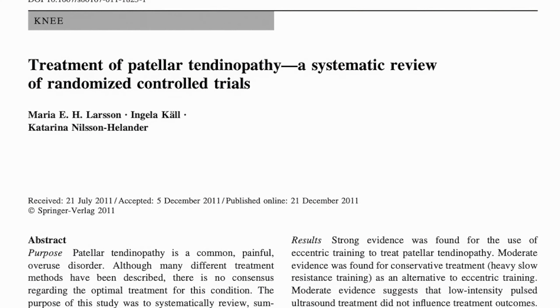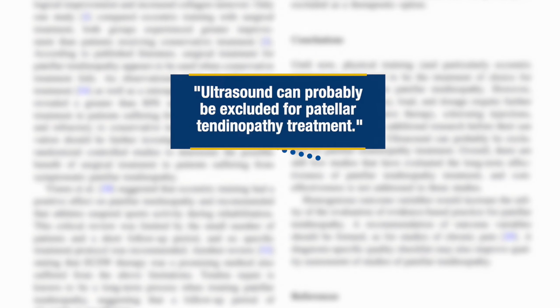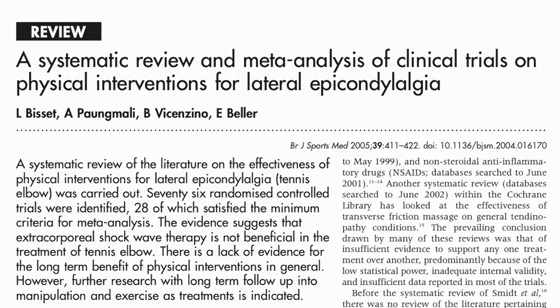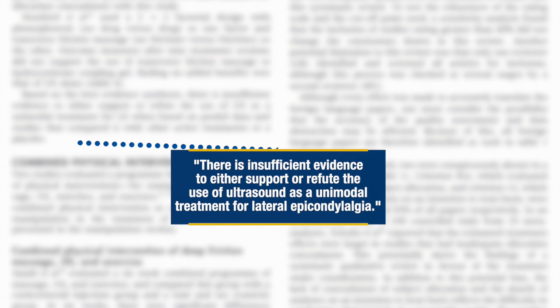For instance, a systematic review of 13 randomized controlled trials of patellar tendinopathy patients concluded that, based on the limited available evidence, ultrasound should probably be excluded as a treatment option for this condition due to its marginal efficacy. Another systematic review of randomized controlled trials in lateral elbow tendinopathy found insufficient evidence to support or refute the effectiveness of ultrasound as a lone treatment.